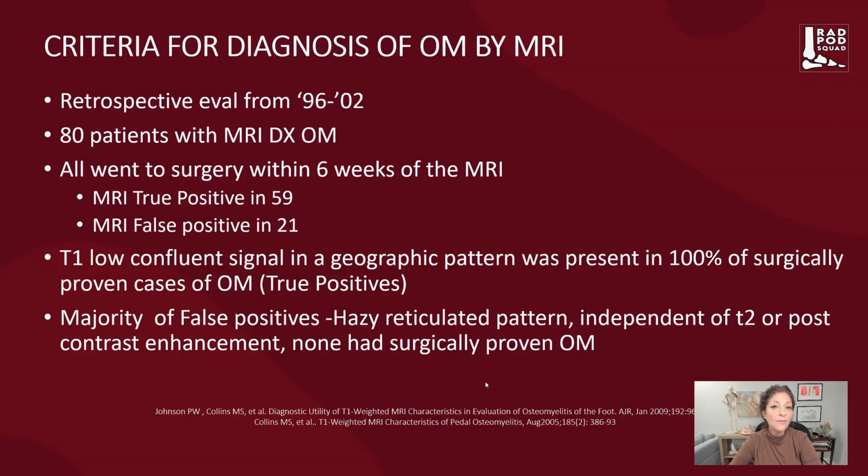And the majority of false positives are when the reading physician was saying that there was a hazy reticulated pattern, independent of T2 or post-contrast enhancement. None of these patients who had that hazy reticulated pattern had osteomyelitis on this study done by Collins.